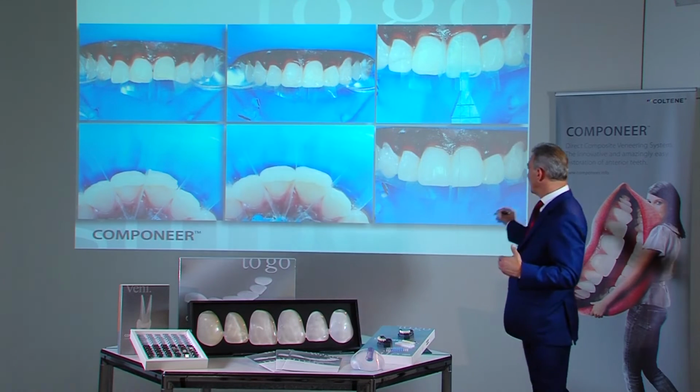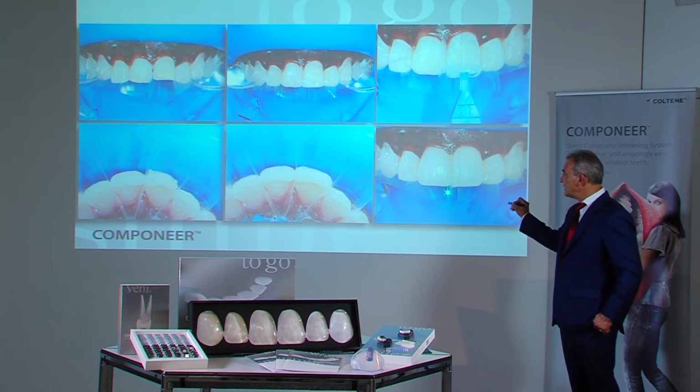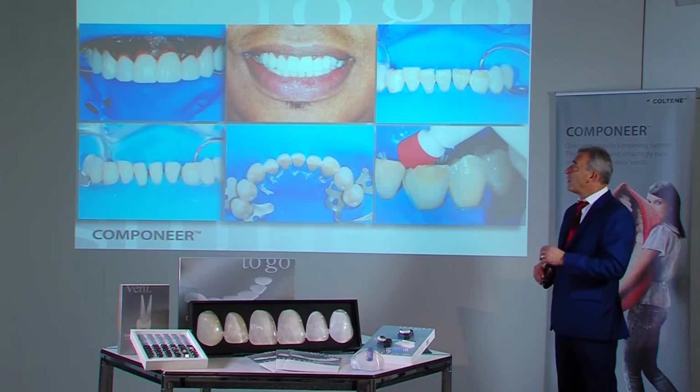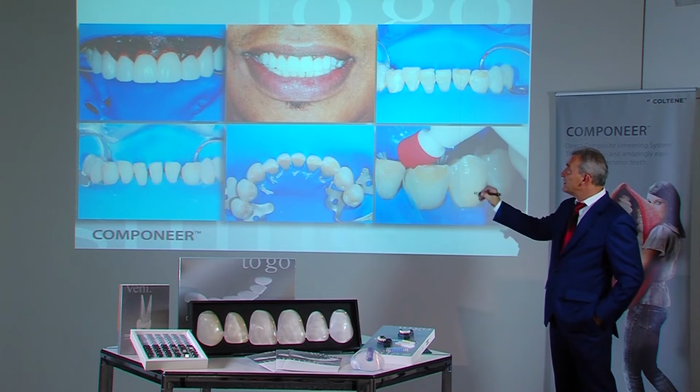At the bottom right, the componeer is shown cured, and the matrix stands straight. If this had not been corrected, then the teeth would again stand in the wrong position. The teeth are now aligned.